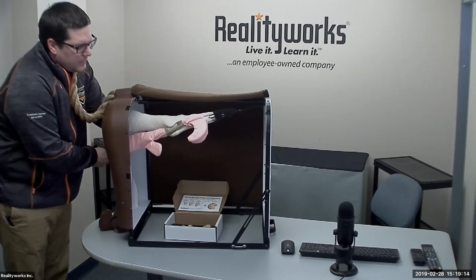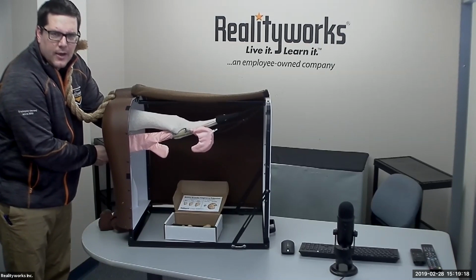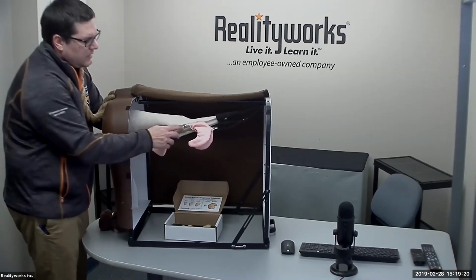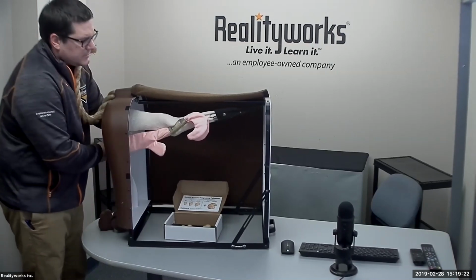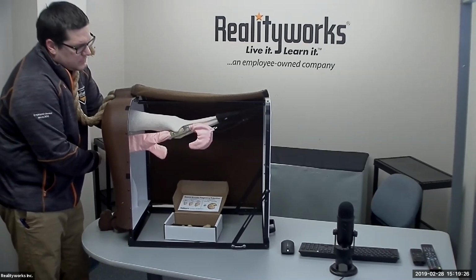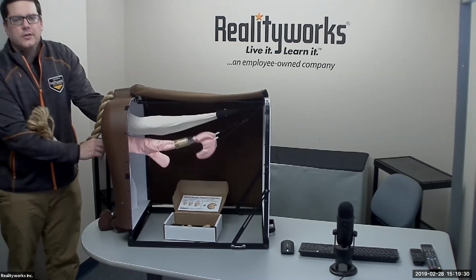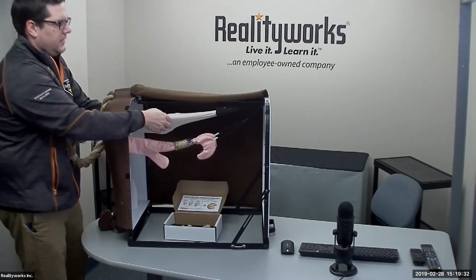And when I am done, if I put my finger on top and push down, I can then see and also feel, yes, I have gotten to the right place. And in this case, I then just have to push in, and I have inseminated the animal.